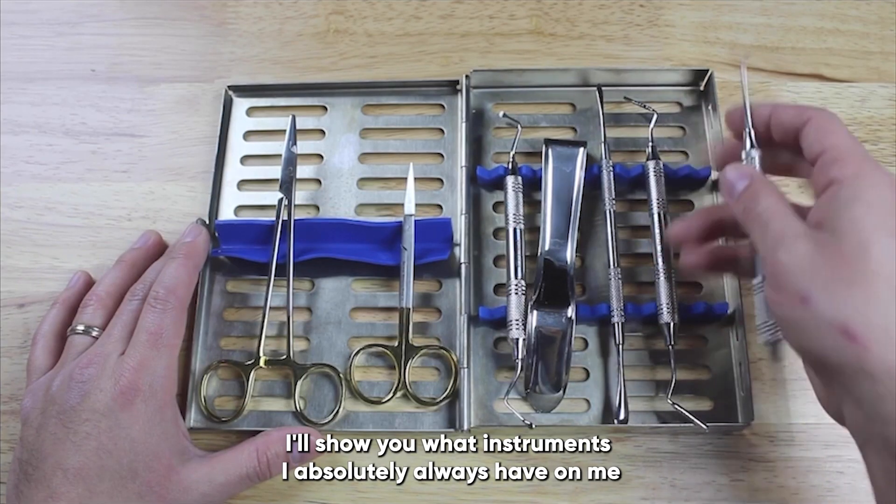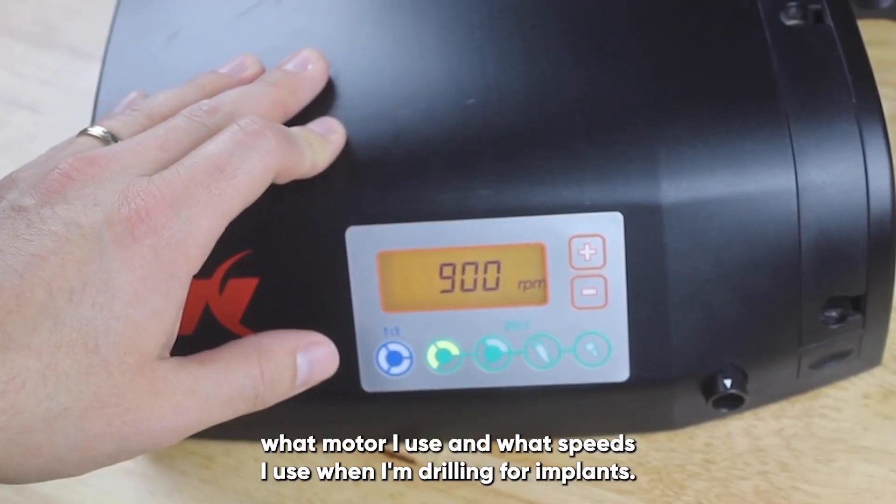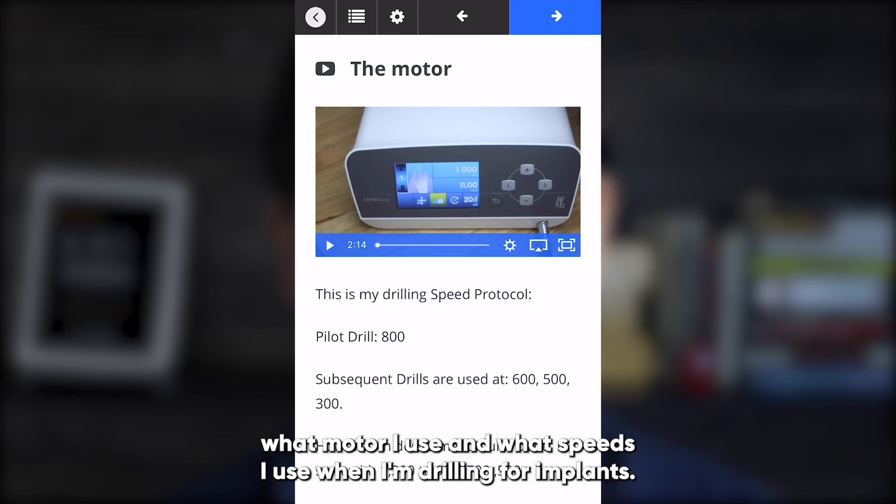I'll show you what instruments I absolutely always have on me and which instruments are just nice to have. I'll also be showing you what motor I use and what speeds I use when I'm drilling for implants.